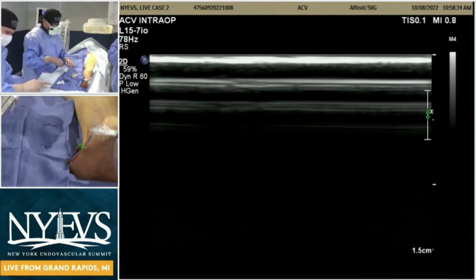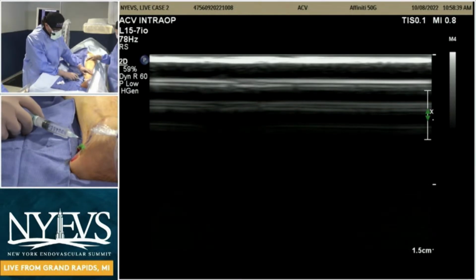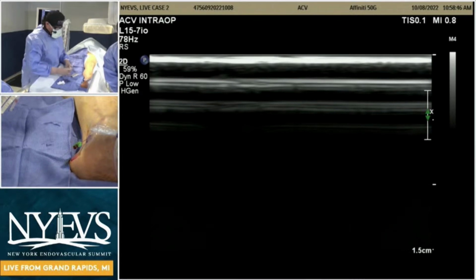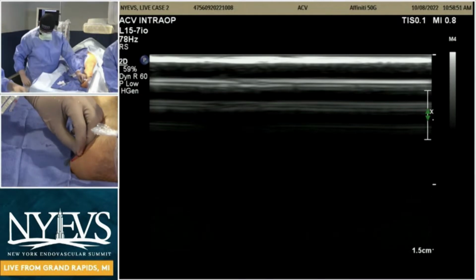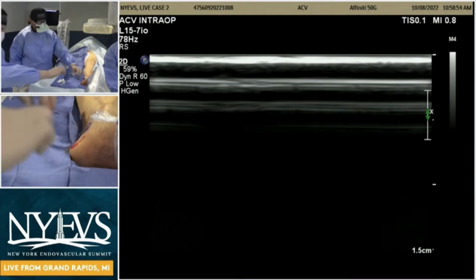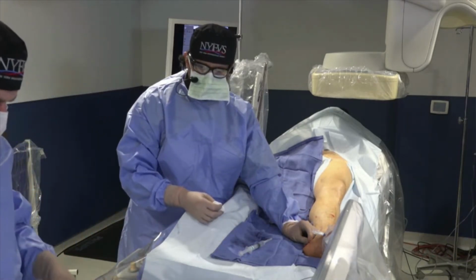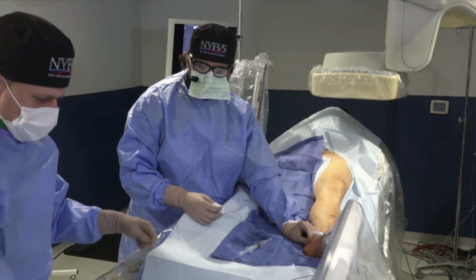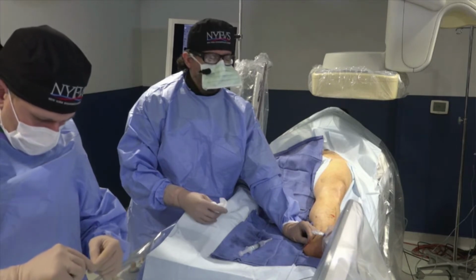Brian? Yeah, I'd like the retrograde tibial approach here. In the event that you have issues, previous bypasses, fem bypasses with a prosthetic, you get a hematoma, it gets infected, it's an absolute nightmare. And it only takes that to happen a couple of times before you really start to rely on primary pedal access. It's funny, I actually learned a lot of my technique from Fadi and Jihad, and so I tend to mimic what they do. They really have revolutionized that retrograde access and when it can be utilized in the correct way. Sure. Karthik, any thoughts on how you would approach this?